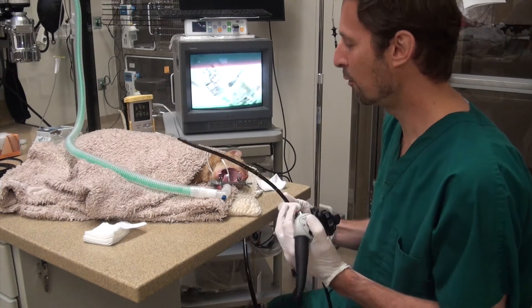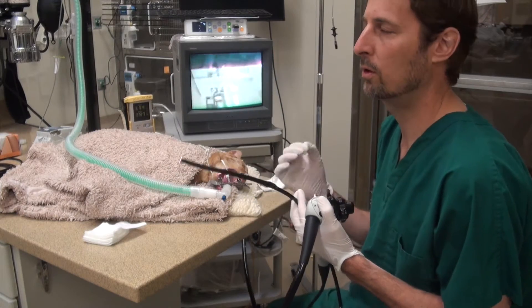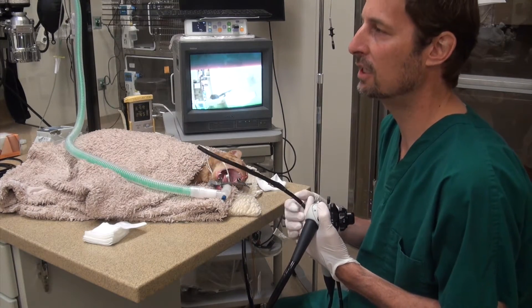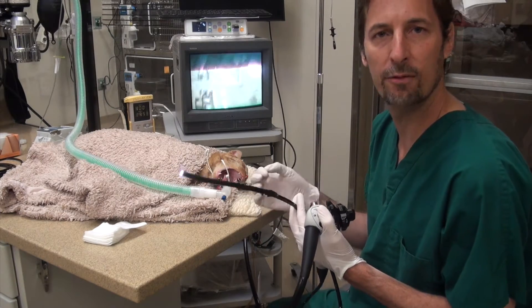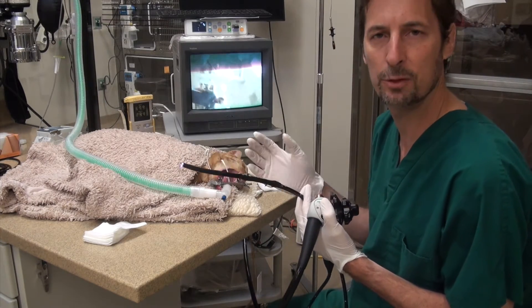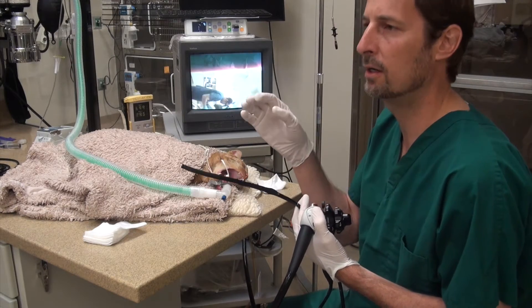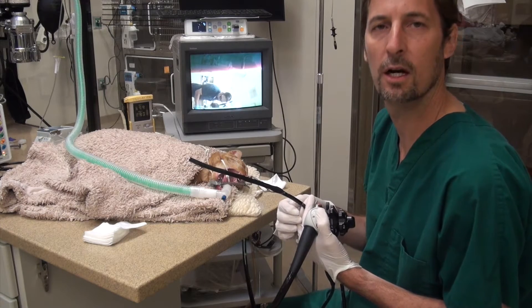Hey everyone, this is Dr. Hughes. We have a younger cat here that swallowed a possible foreign body. Usually cats love to eat string, any type of yarn, any kind of fishing line — they love to eat long stringy things. We think there's like a five-inch piece of yarn. We did an x-ray and gave some barium, and the barium is highlighting some type of foreign body there.